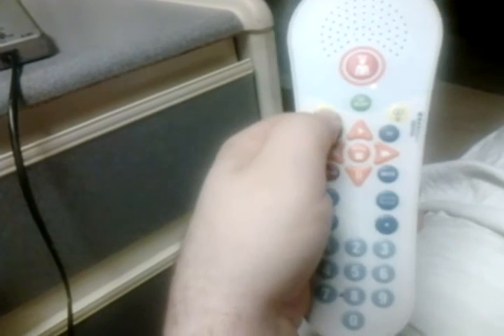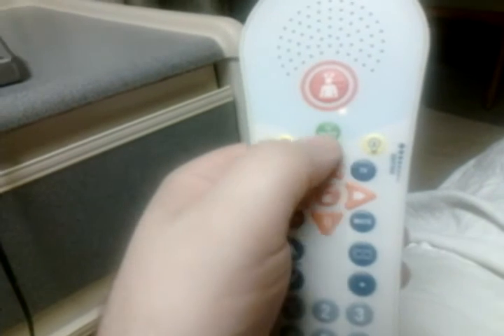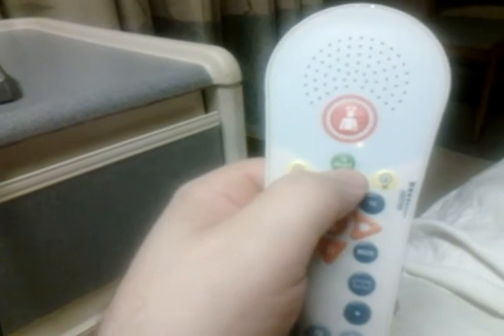The buttons are very unresponsive. Here's the light button — it says light one and light two. Light two doesn't do anything, but light one, if you just press it — now it worked. There's also a little orange LED. Sometimes these buttons just don't respond; maybe it takes a little while to wake up.